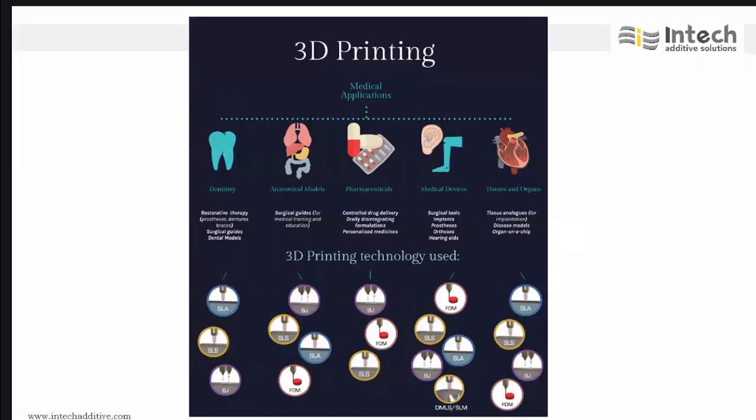So this is about 3D printing technologies in different medical applications. As you could see in dentistry, it's about restorative therapy, surgical guides, and making dental models. And there are some technologies that are used under dentistry. It's about VAT photopolymerization, where we have SLA or DLP.